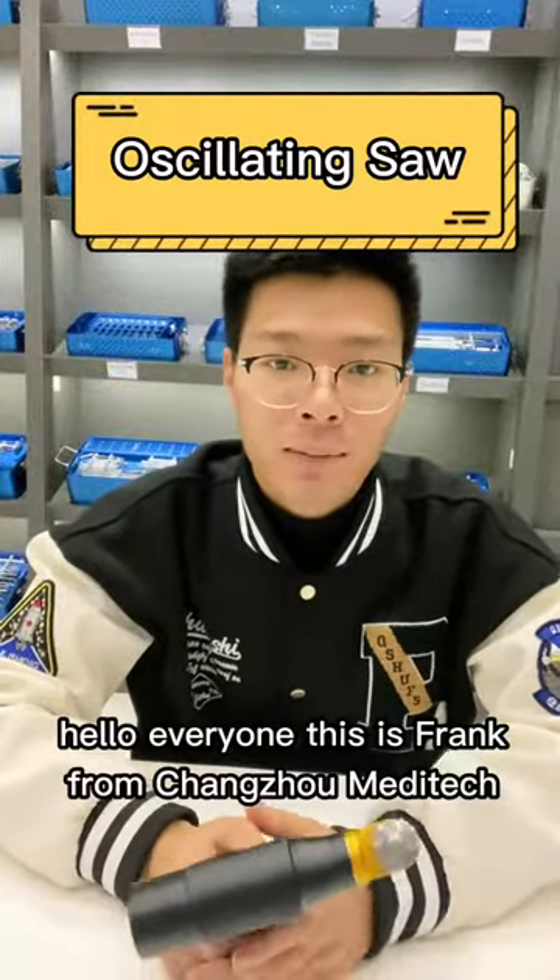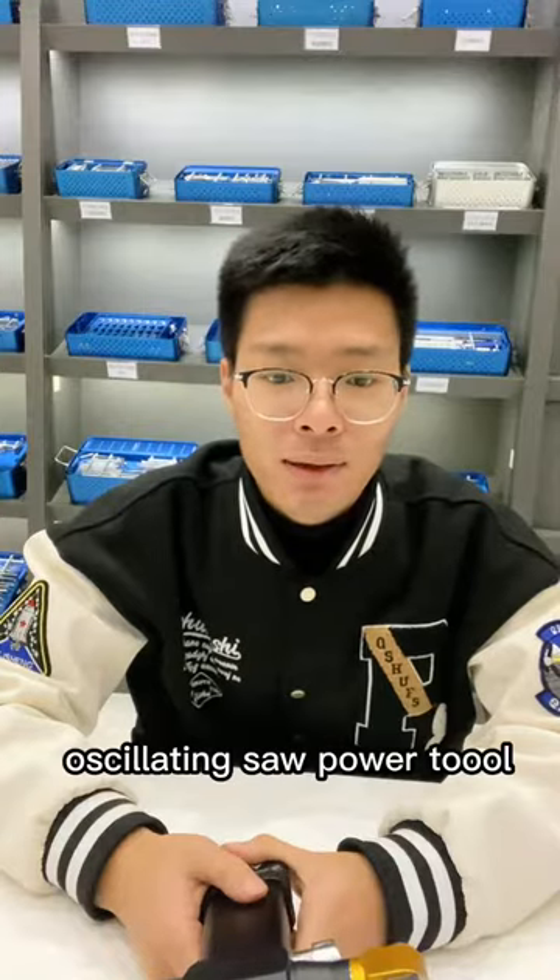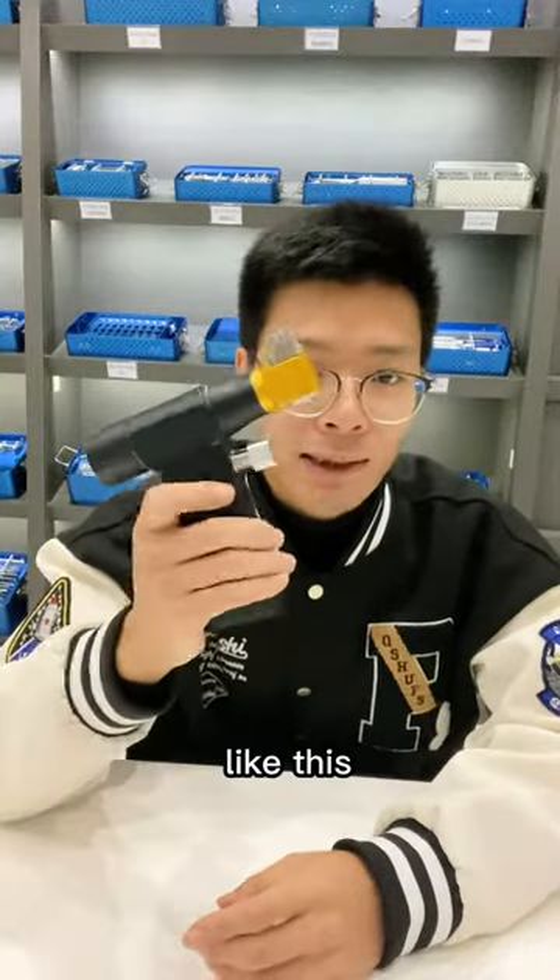Hello everyone, this is Frank from Changzhou Meditech. Nice to see you, and today I will introduce you to our oscillating saw power tool like this.